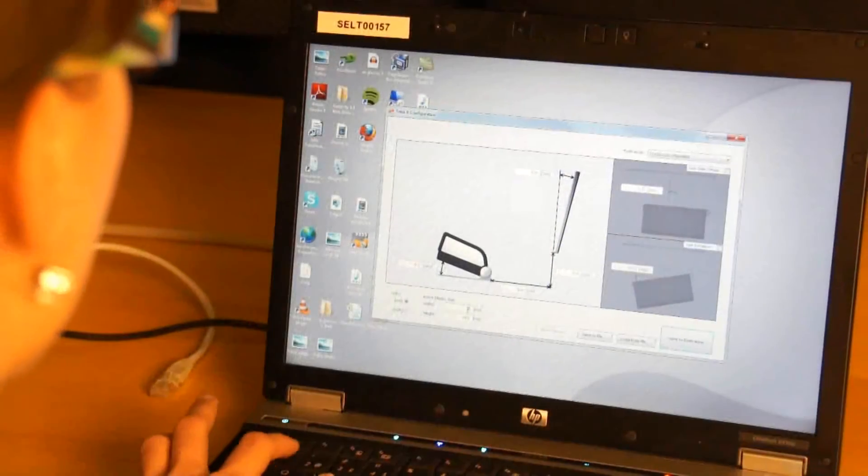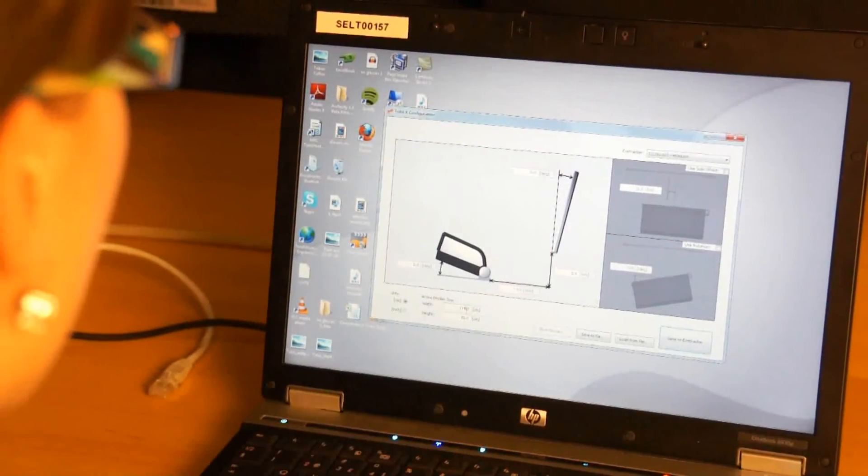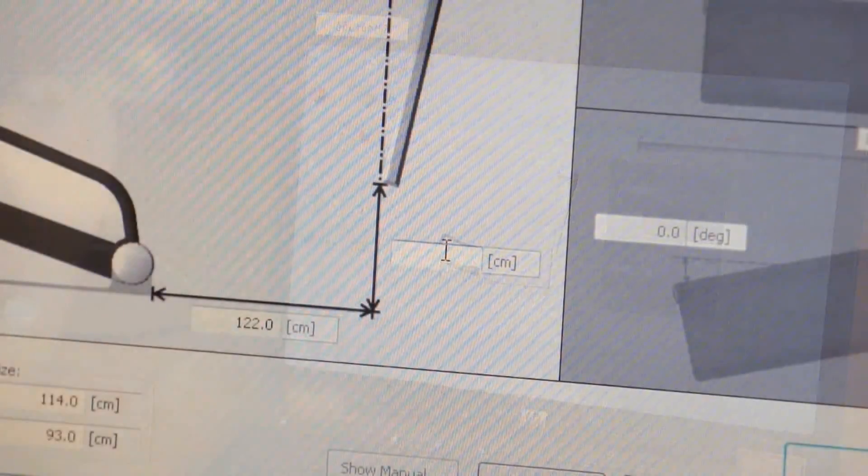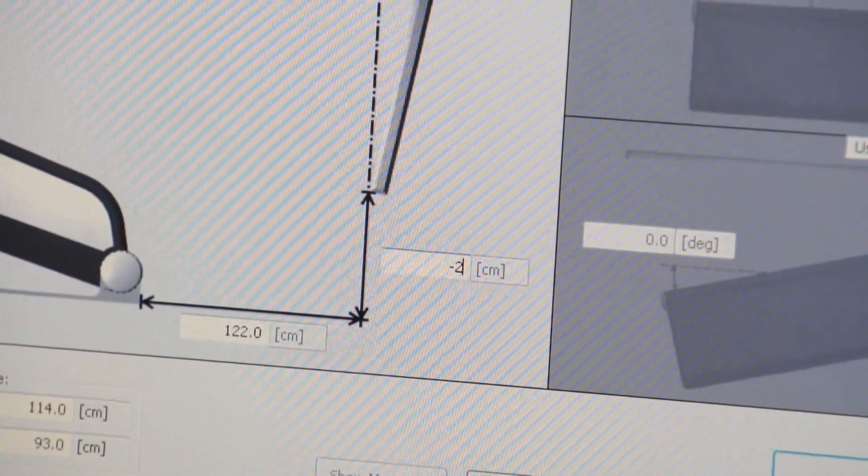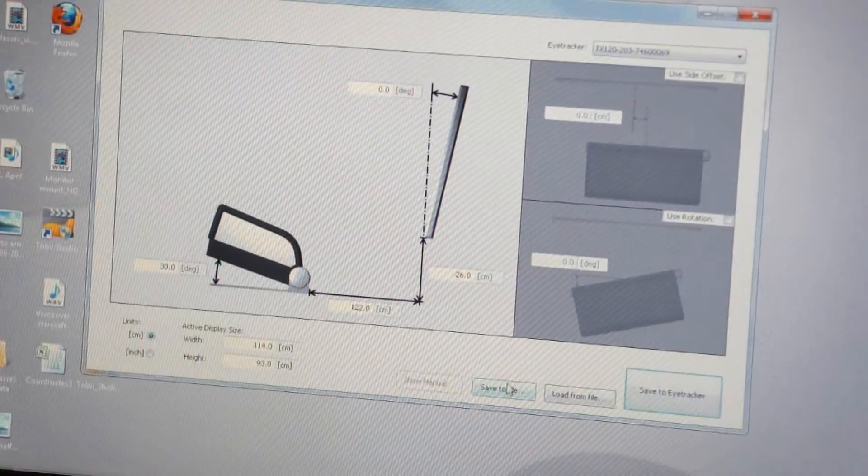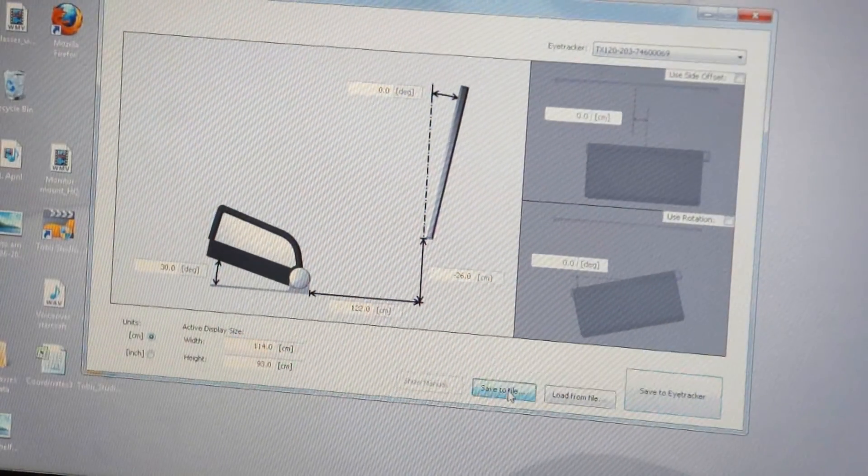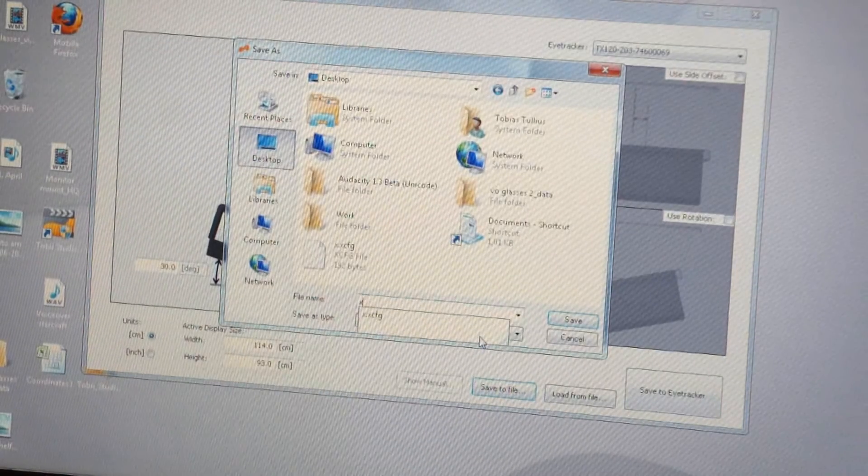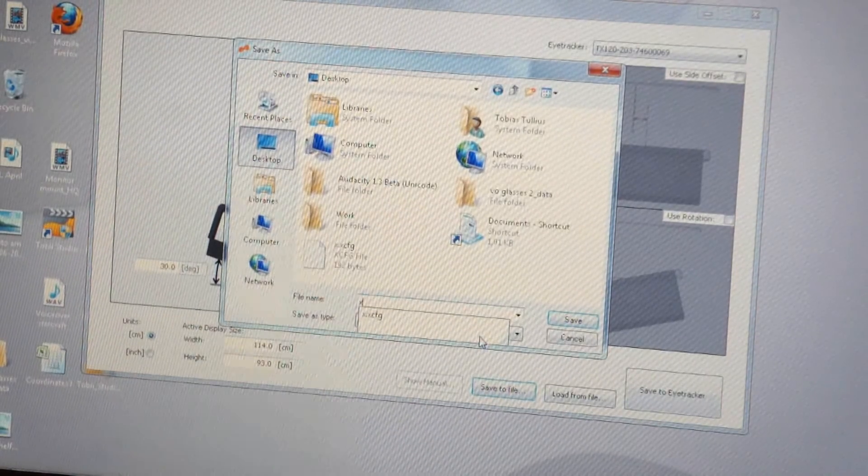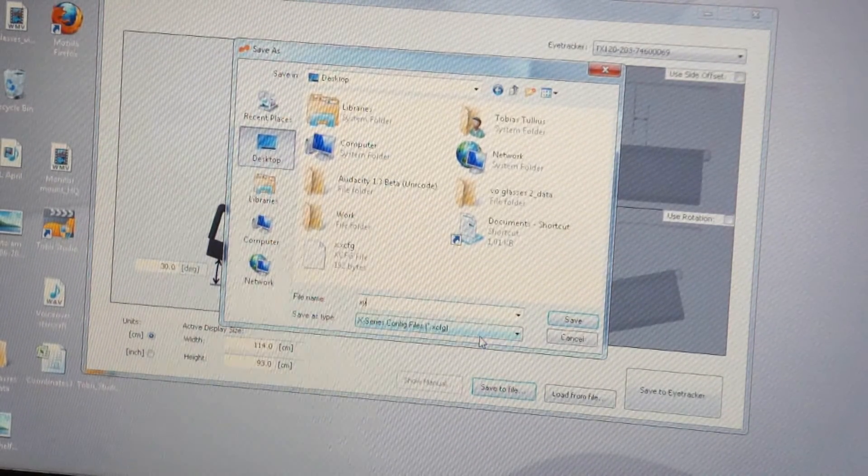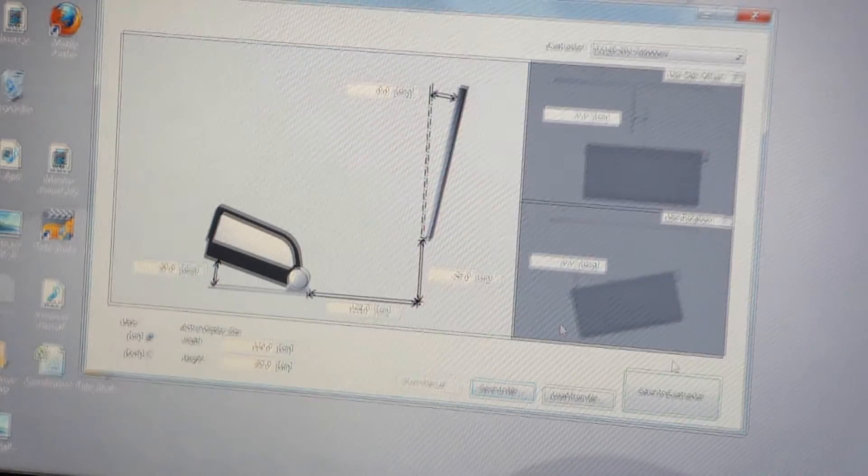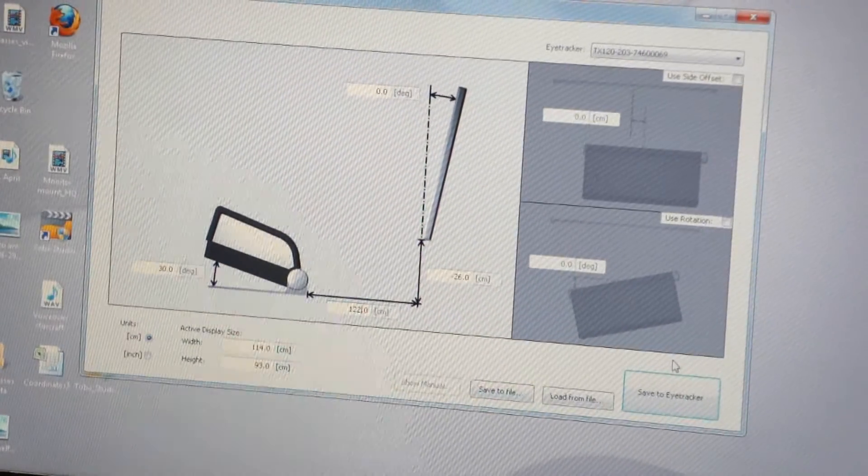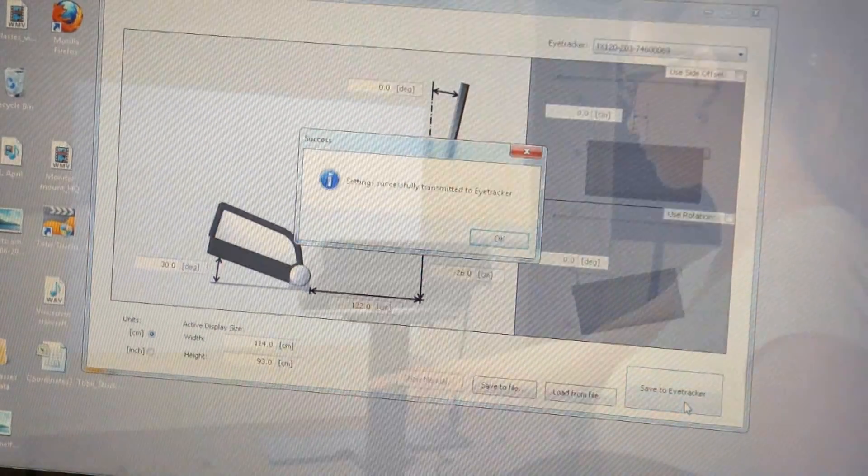After a value is measured, it needs to be entered in the configuration tool. Please note that you can also enter negative values if necessary. It might be useful to save the configuration locally on your computer. This can be used as a local backup in case the settings need to be adjusted later. To start using the configuration, click Save to eye tracker.